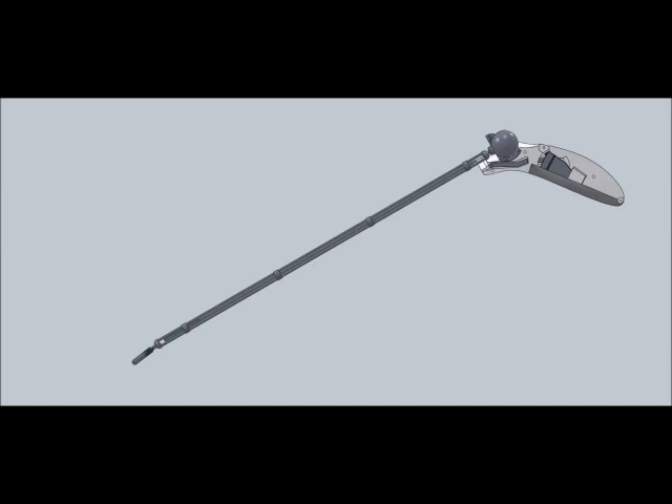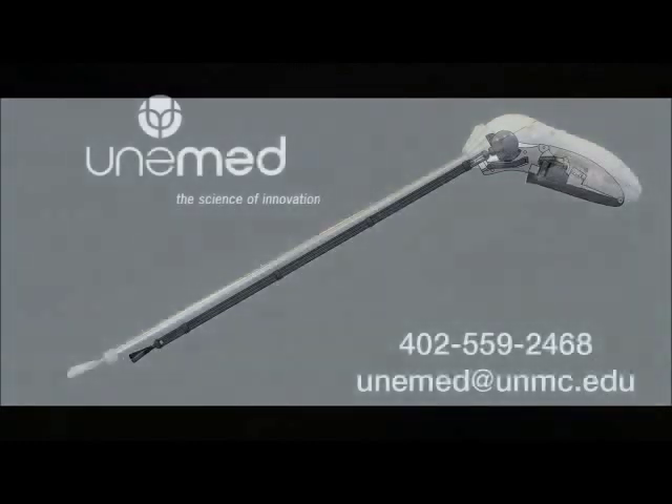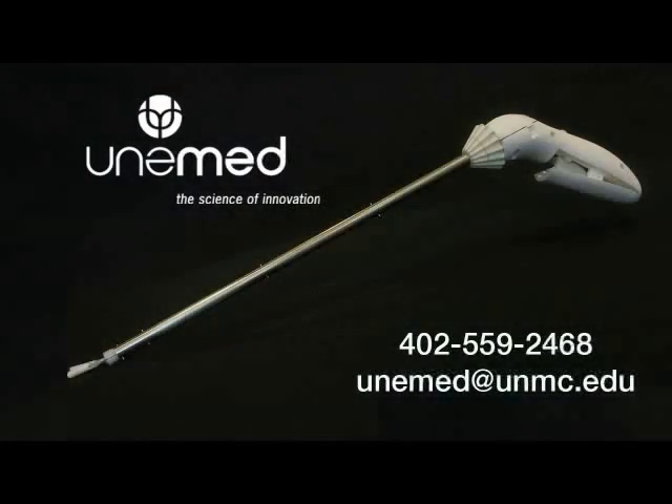Solid rods drive articulation for simpler production and lower costs. Intuitool is a platform — it makes ergonomic articulation possible for any laparoscopic instrument. Feel the difference for yourself. Contact UNeMed to get a prototype today.